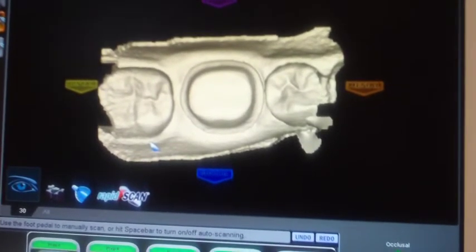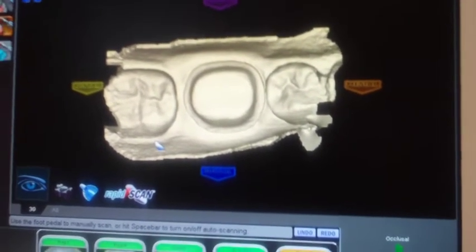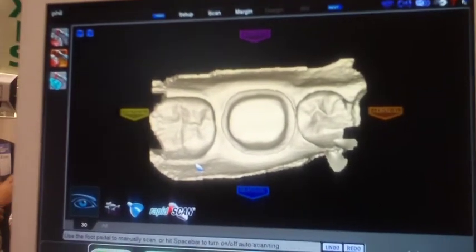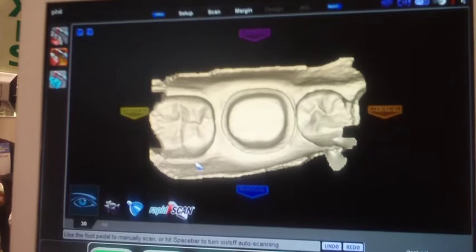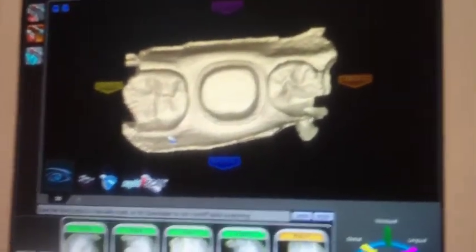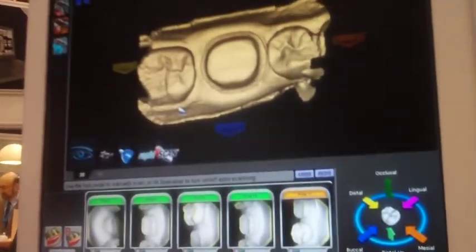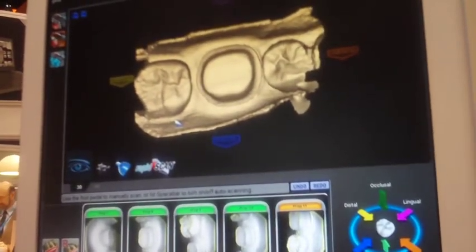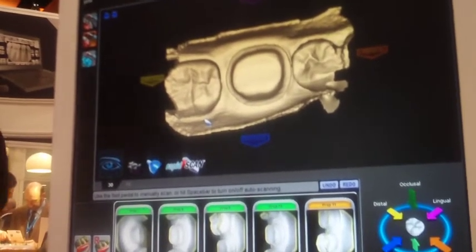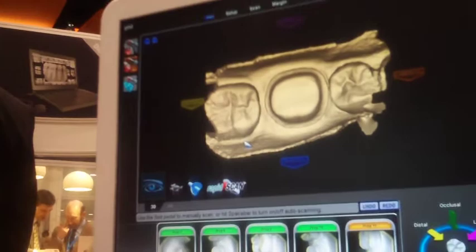To control my bite, I apply bite registration — have the patient bite down, scan the bite, and it matches it up giving me the negative of the opposing tooth — that's how I get my occlusal contacts. It's probably mid to late third quarter that they anticipate having a virtual articulator, where you'd scan the lower, scan the upper, and get the buccal shot. At the end of the day, cone beam integration is coming so you can get the true function of the bite.